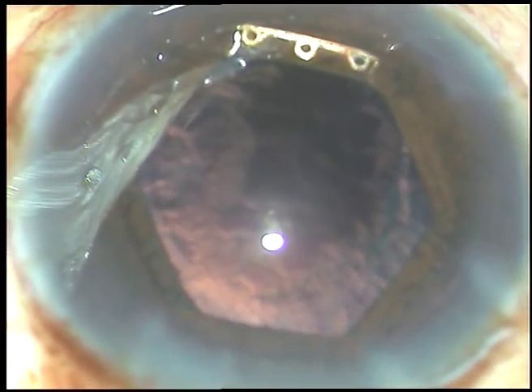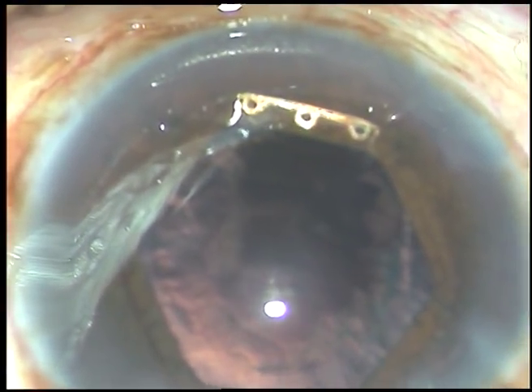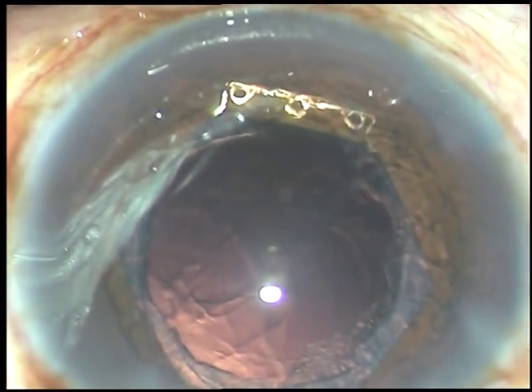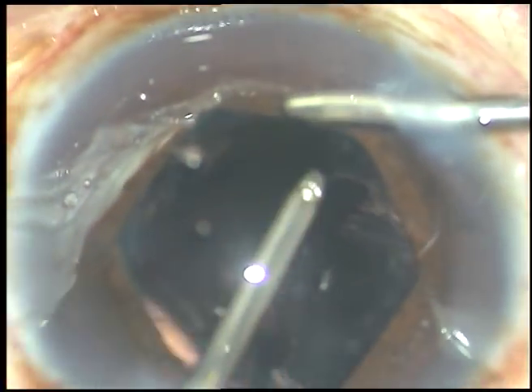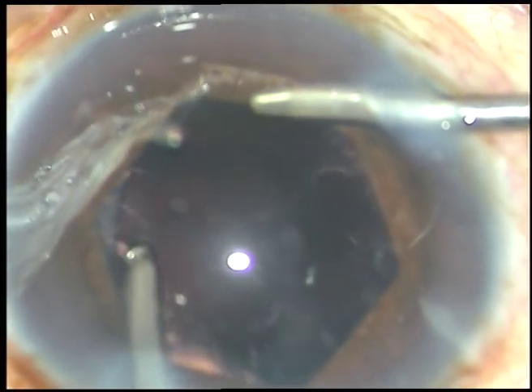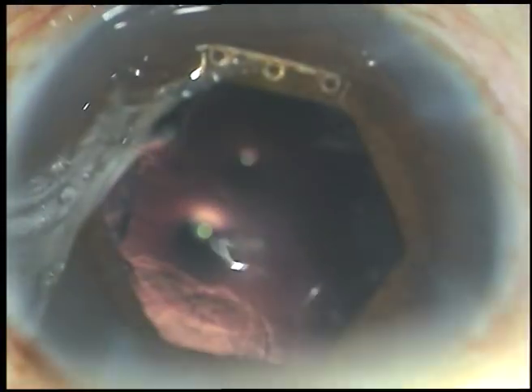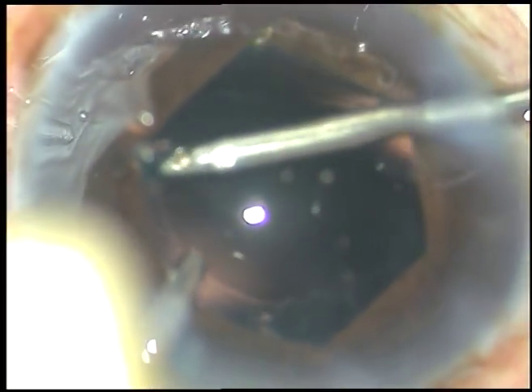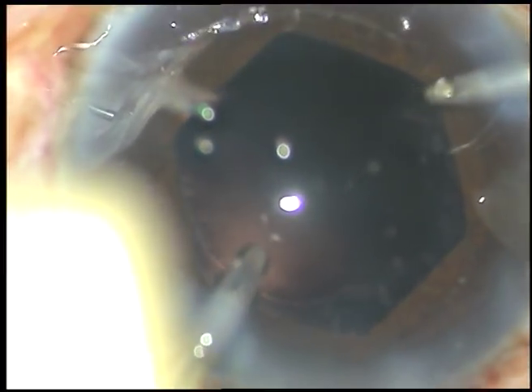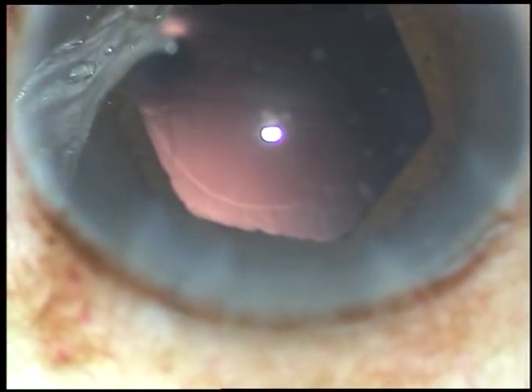Now viscoelastic substance is injected and cortex is cleaned. In this case I am using bimanual irrigation-aspiration for removal of cortical matter. The cortical matter is removed and now a little bit of polishing of the posterior capsule is done — I am using only the irrigating jet or fluid for polishing the posterior capsule.